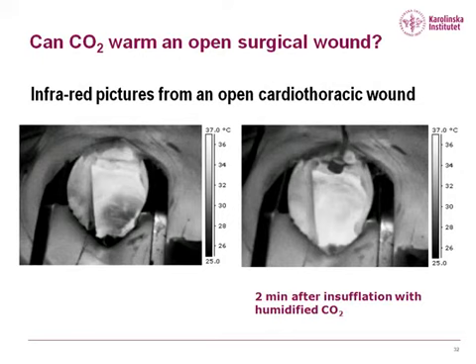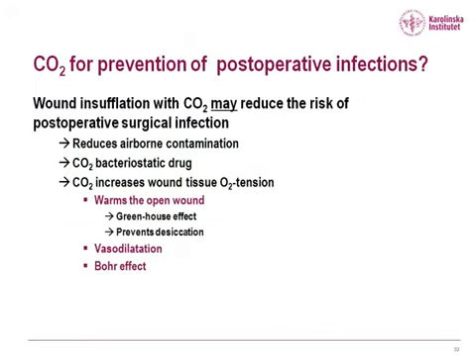But if you insufflate the wound cavity with humidified CO2, the wound edges are much warmer, and so is the right ventricular outflow tract.